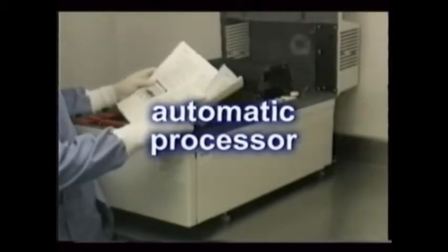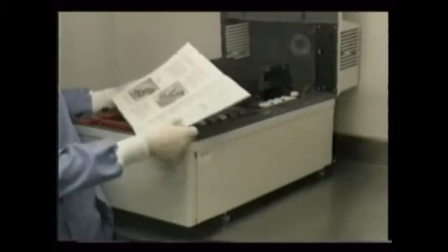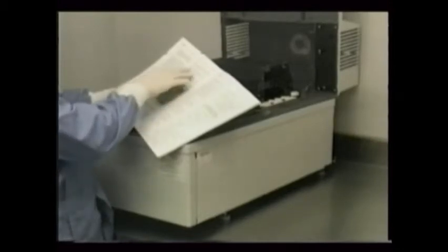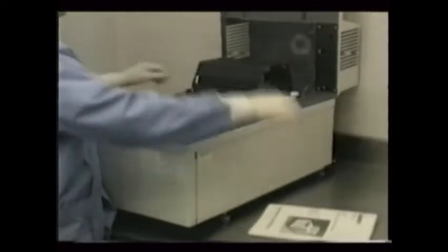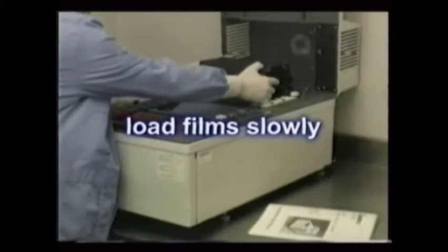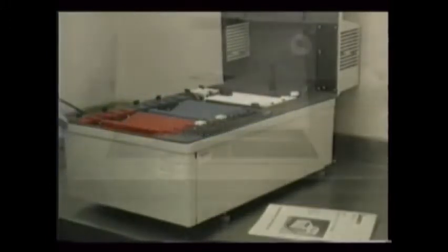When using the automatic processor, you must follow the manufacturer's instructions in use and maintenance to avoid failure. Chemical temperatures, the timing, and sometimes even chemical replenishments may be totally automatic. The most important thing you need to pay close attention to is loading the films slowly so they have time to spread out and not overlap and stick to each other.